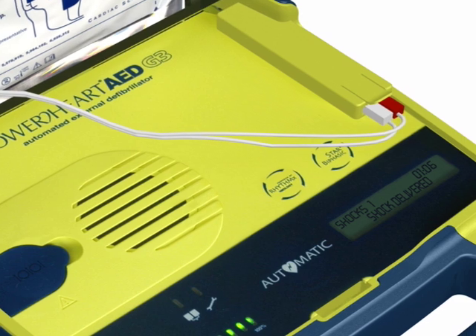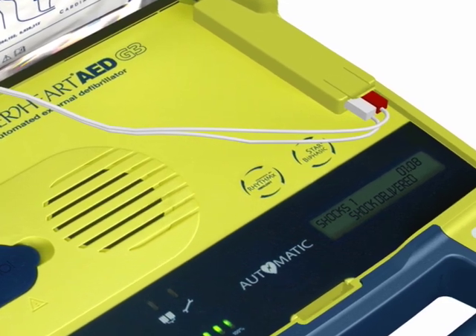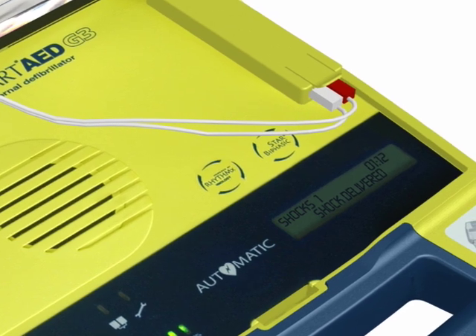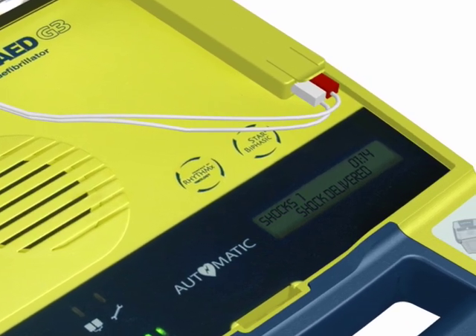It is important to note that the PowerHeart AED G3 Plus has been designed to only deliver a shock when one is needed. You cannot accidentally shock someone.